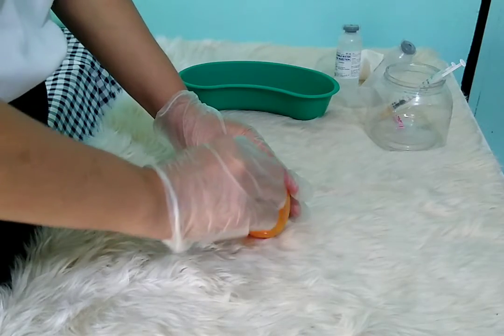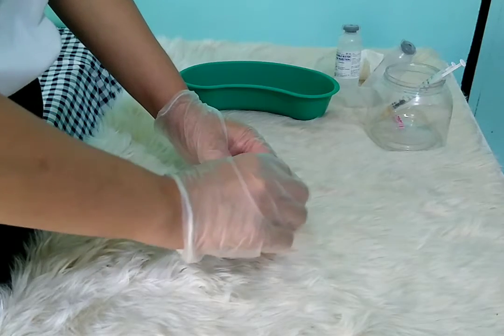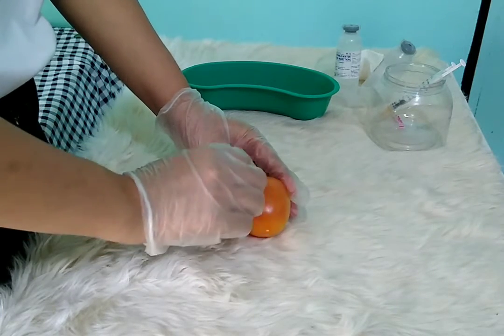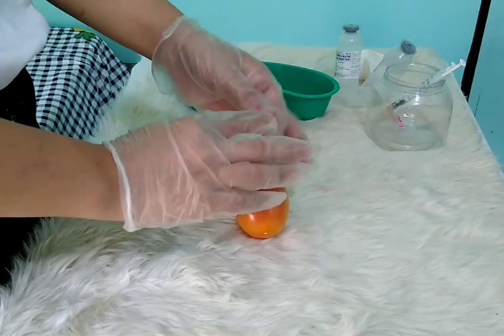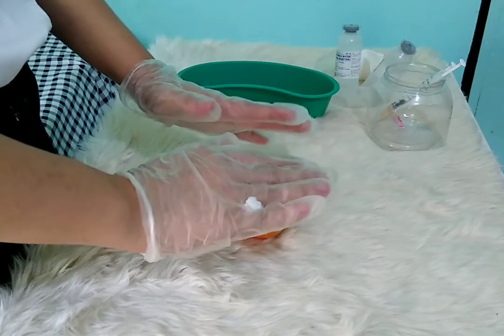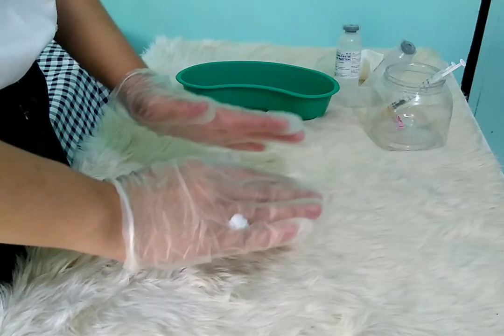Start at the center of the site and clean, widening the circle to about 5 centimeters. Allow the area to dry thoroughly and hold the swab between the third and fourth finger of the non-dominant hand, or position the swab on the client's skin above the intended site.